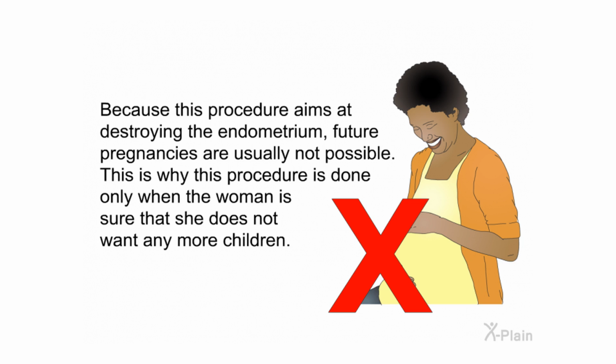Because this procedure aims at destroying the endometrium, future pregnancies are usually not possible. This is why this procedure is done only when the woman is sure that she does not want any more children.